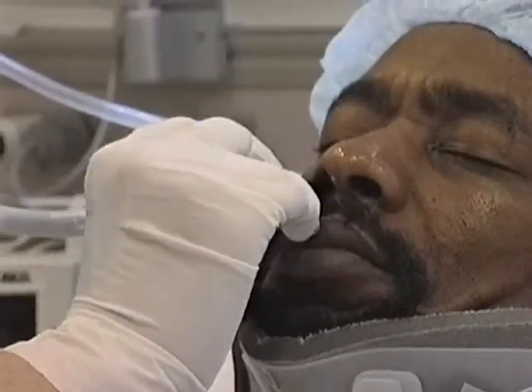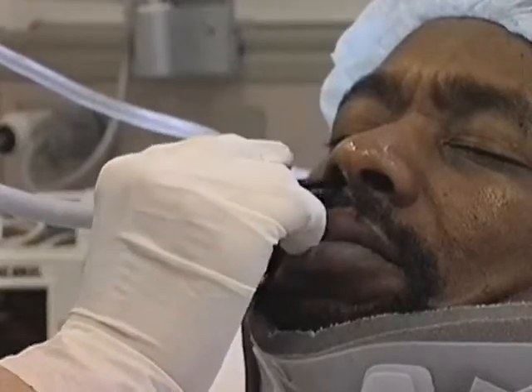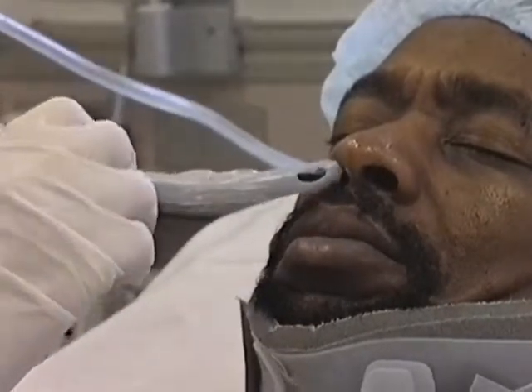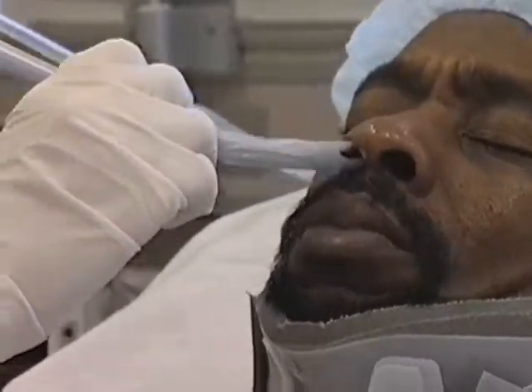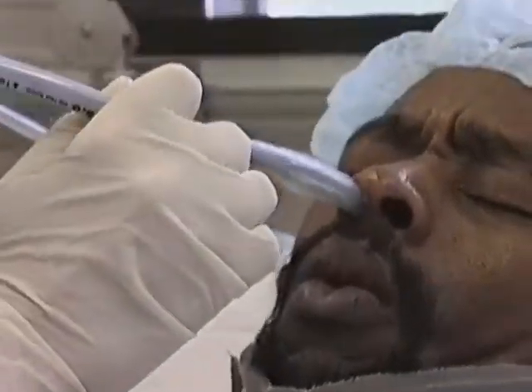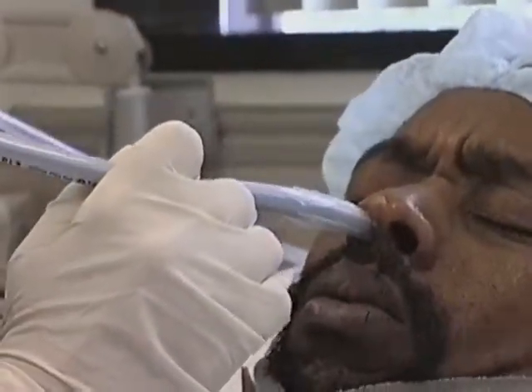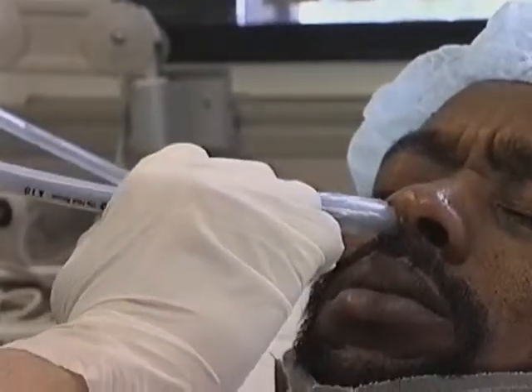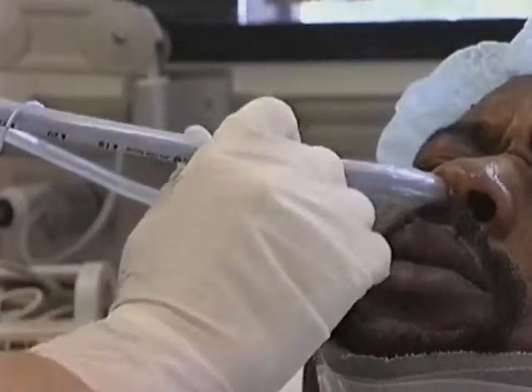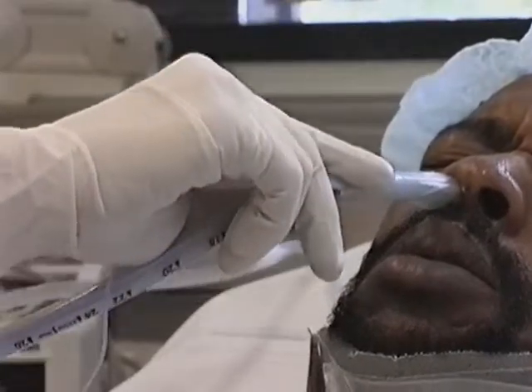Stabilize the fiber at the nose. Slide your well-lubricated endotracheal tube down the fiber into the nose. Advance it until it enters the trachea. You may need to rotate the endotracheal tube slightly if it meets resistance.